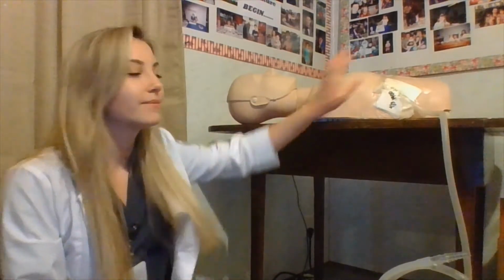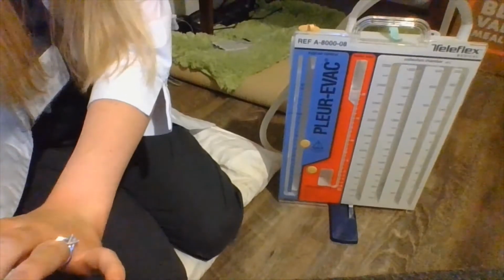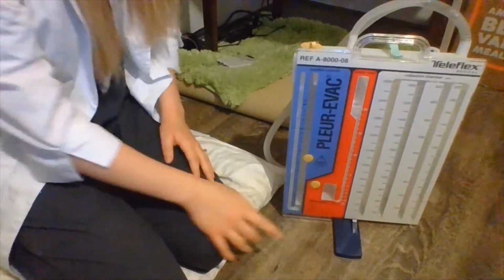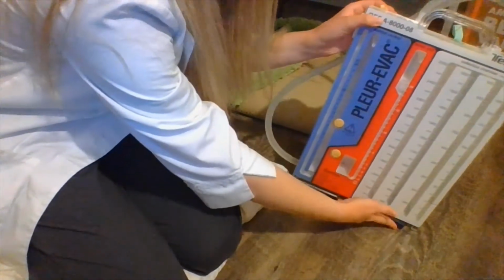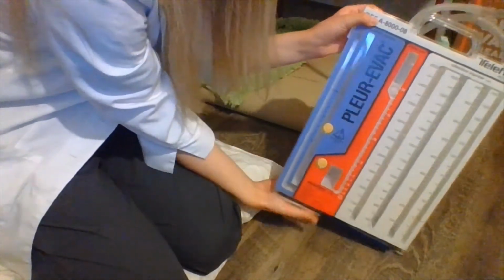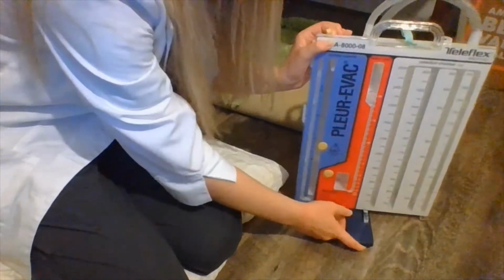So this is going to be my patient for the day, and he has a chest tube that is connected to wet suction. He has an occlusive, airtight dressing right here to prevent air leaks. To manage his tubing system, you want to make sure that the drainage system stays below his chest. As you can see, my drainage system is right here. I have it propped up on this little stand that is attached to the bottom. Normally it would be turned in like so, but you can pop it out and it'll easily stand on the floor.